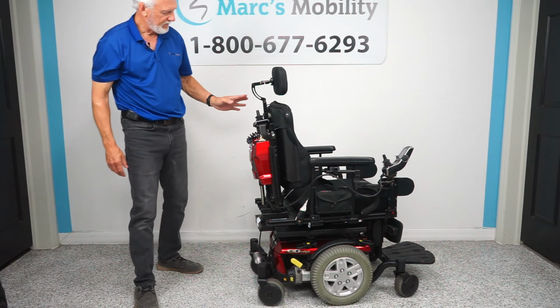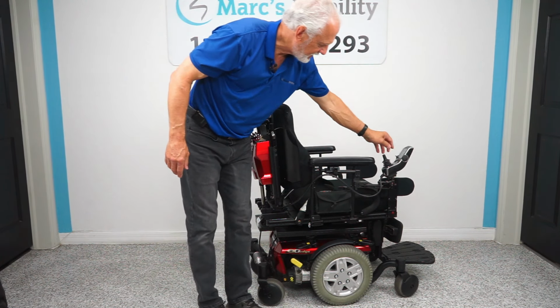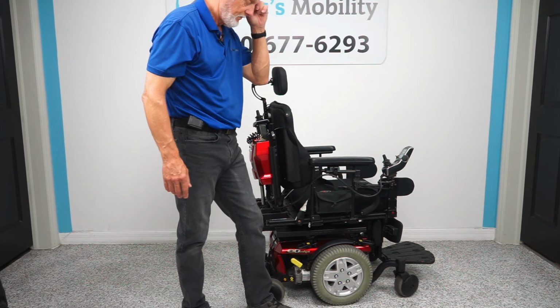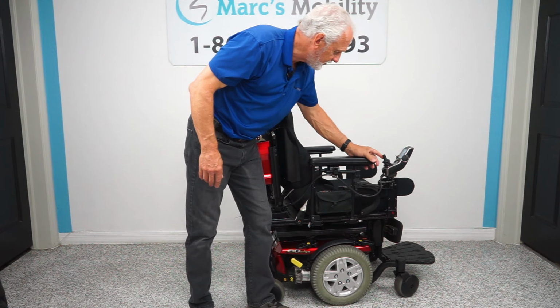So, is there anything else we need to cover on this chair? So we've got that. The joystick, let's put it back in drive, because once you take it off over here, you have to turn the power back on over here to get it back on. Give it a few seconds. Now we're back in drive. We're going to speed it up a little bit.